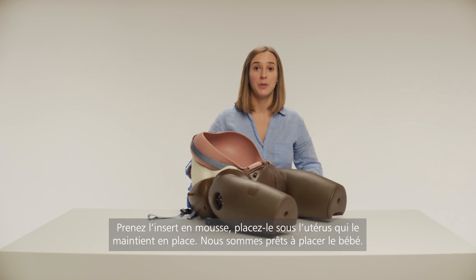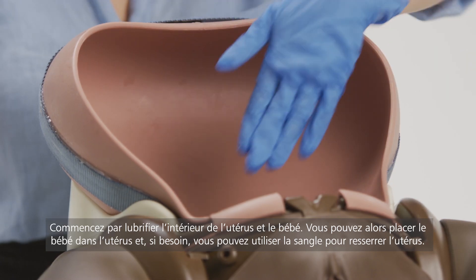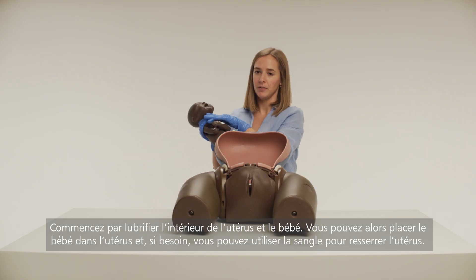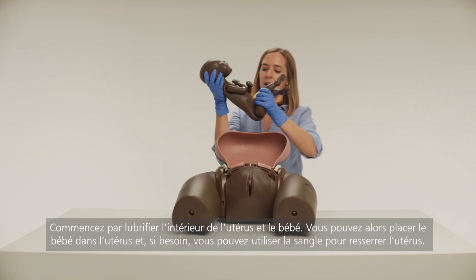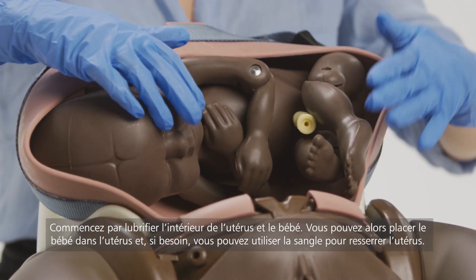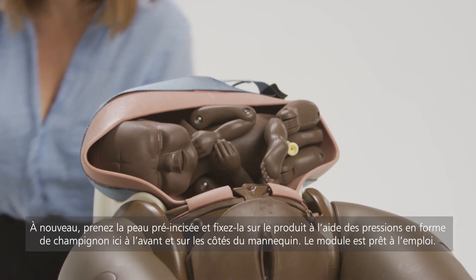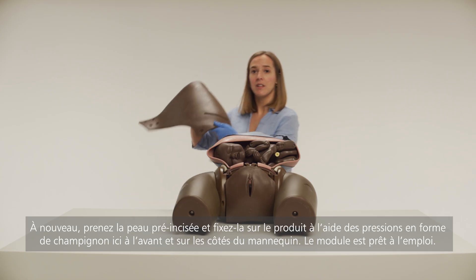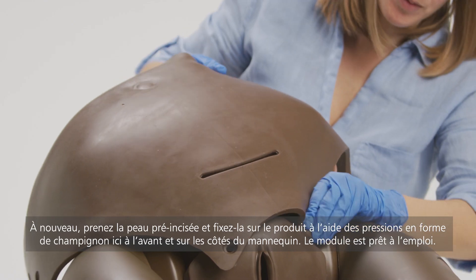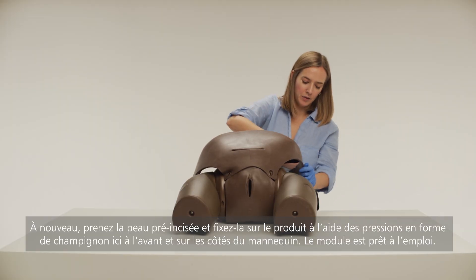We're now ready to insert the baby. Start by using lubrication to lubricate the inside of the uterus, as well as the baby itself. You can then place the baby inside the uterus. And if desired, you can use the strap to tighten the uterus. Once again, take the pre-incised abdominal skin and attach this over the product, using the mushroom-shaped poppers here at the front and to the side of the product.